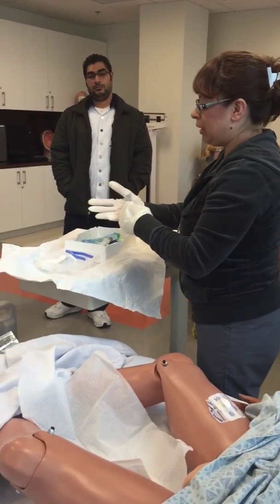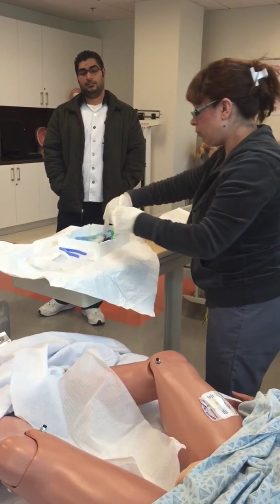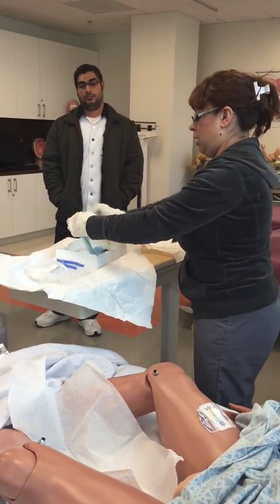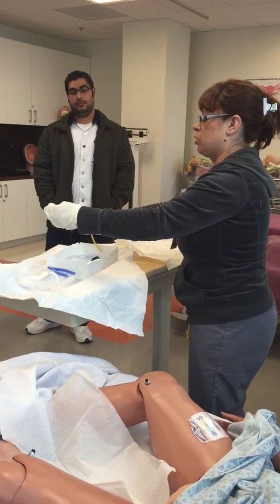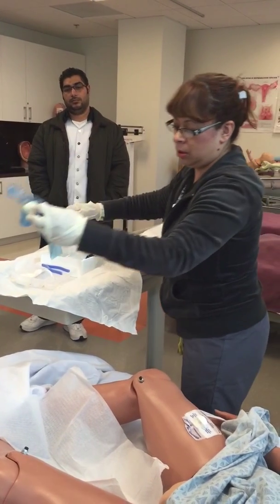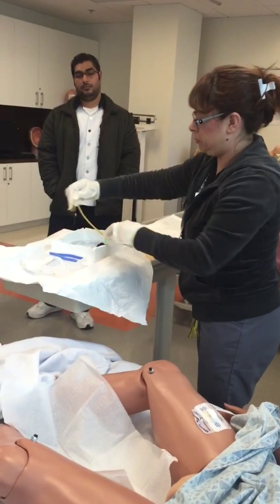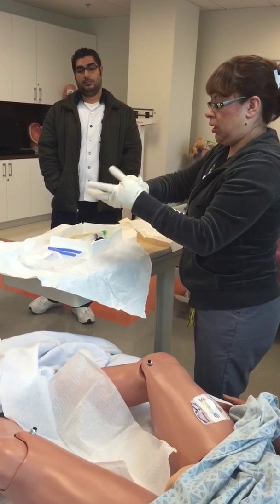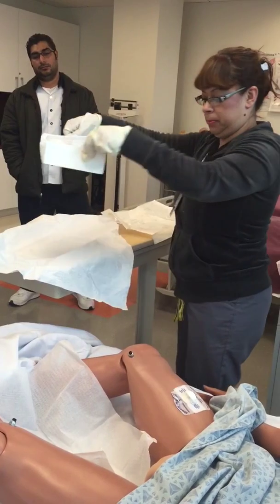I'm going to open my lube, pour it in here, and lube my catheter. Take this off, and when you take it off, make sure you're holding it very well so it's not flopping all over the area. Okay, I'm going to lubricate. You can put that back. Now I can bring this to my area.